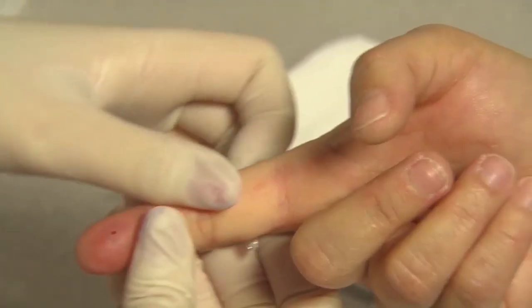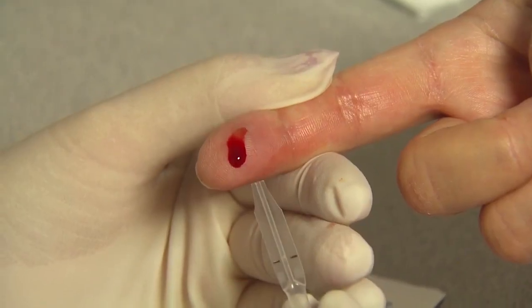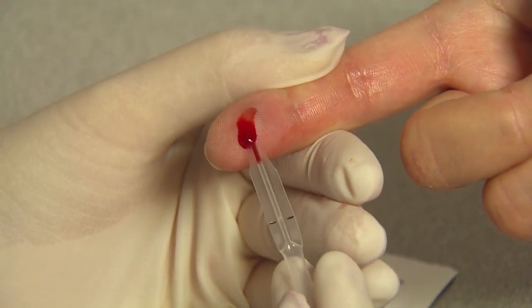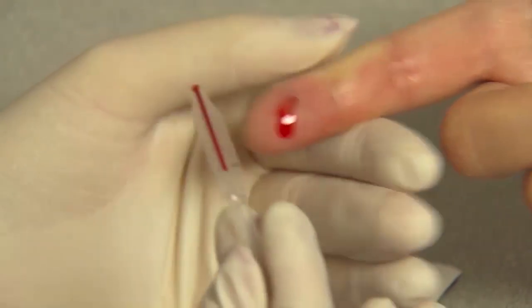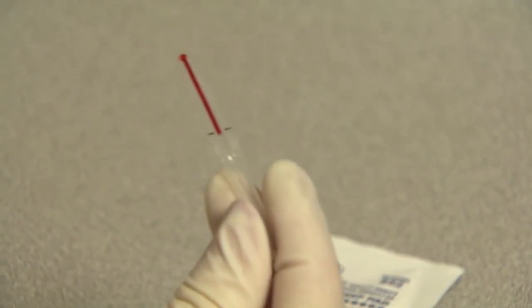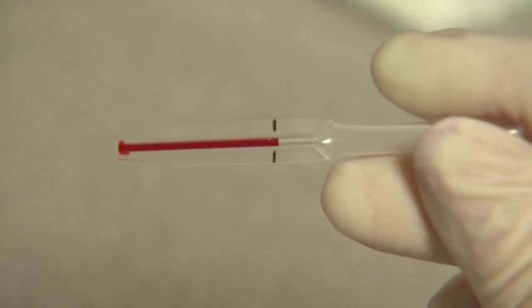Apply light pressure to obtain a second drop of blood. Do not apply the specimen sample directly on the test strip. Collect capillary blood of 10 microliters using a capillary transfer tube or pipette. The capillary transfer tube will fill automatically. It is important to use the capillary transfer tube to collect the specimen in order to receive accurate results. Make sure the blood covers the air vent of the tube or it will be difficult to squeeze the blood out. Never squeeze the capillary transfer tube while sampling.